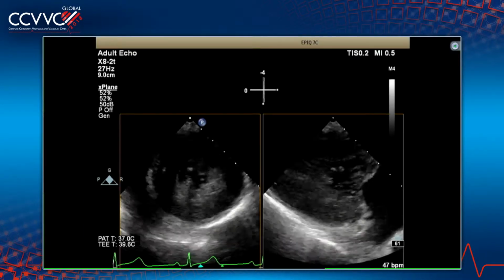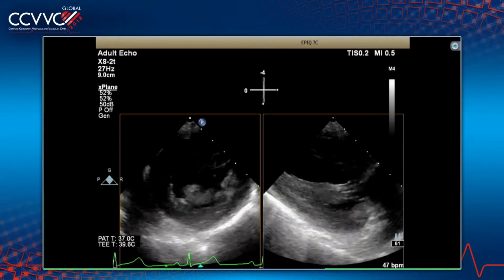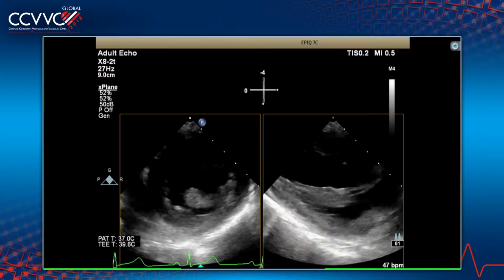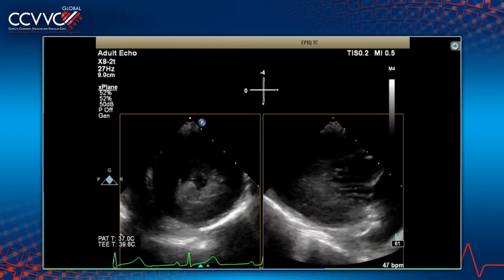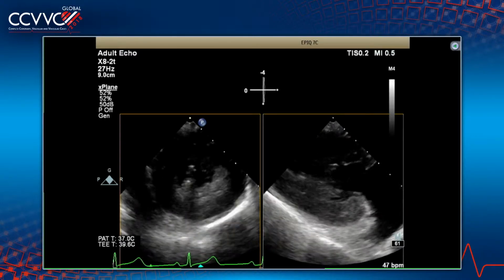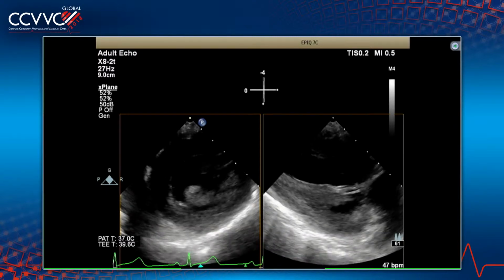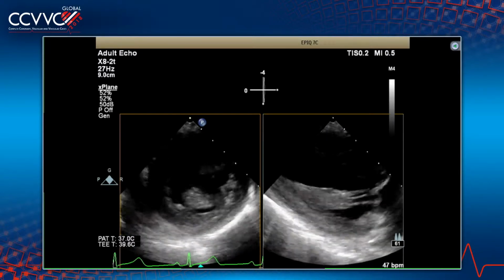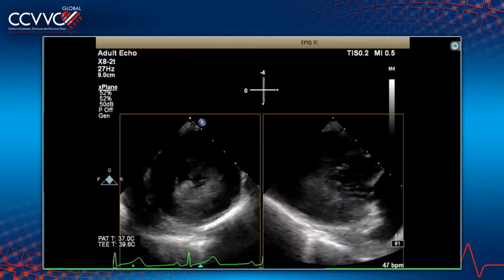Cath had shown mild non-obstructive CAD, and as we'll show you in the pictures, the left main had an acute upward takeoff. So our concern is that there could be obstruction of the left main when we are doing the TAVR in this prosthetic valve. Her STS mortality risk was 9.9. We have the surgeon here, Gilbert Tang. Heart team discussion made her high risk, and that is why she's here for TAVR, valve in valve.